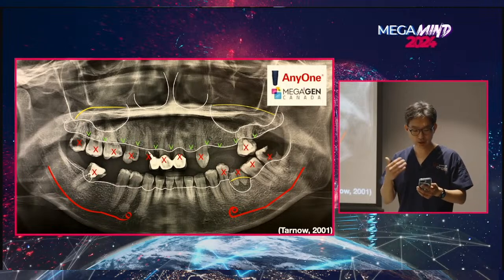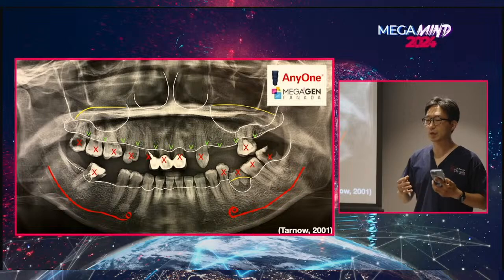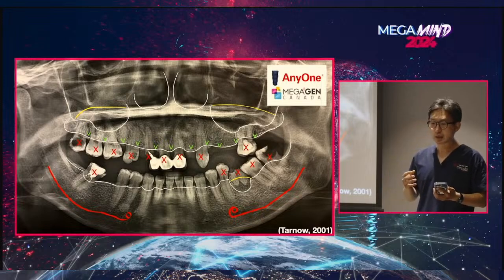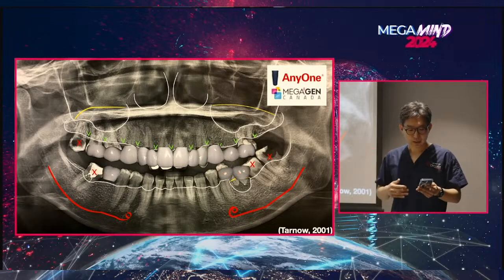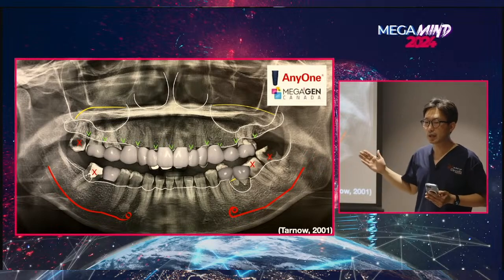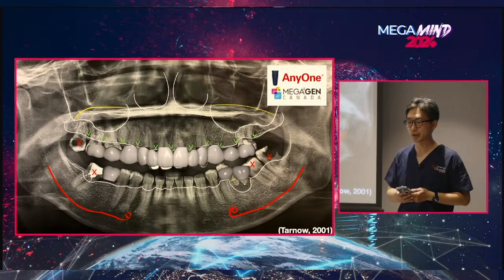And in terms of my prosthetic design for the maxillary fixed prosthesis, I wanted to keep it as simple as possible. I wanted to avoid cantilever, and I wanted to provide her with 4 3-unit segmented bridges. By keeping it simple, these prosthetic implants can be repaired and replaced by any dentist if needed in the future.